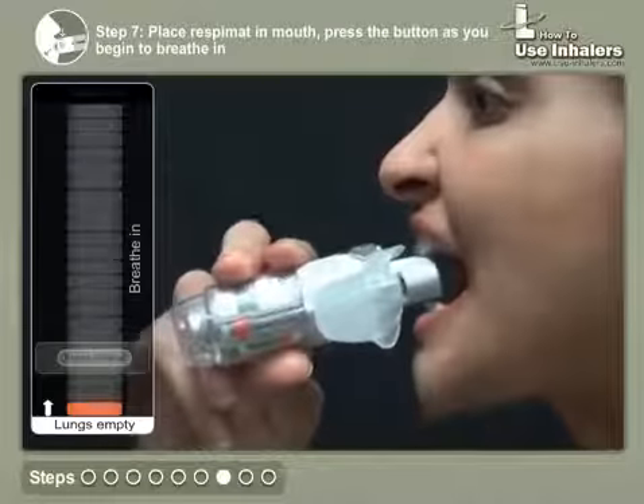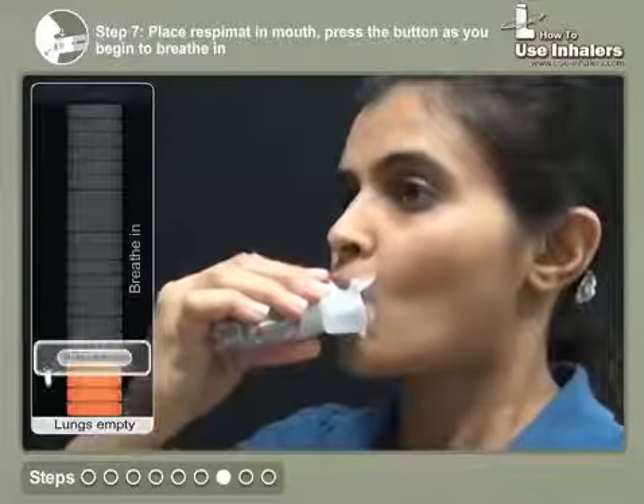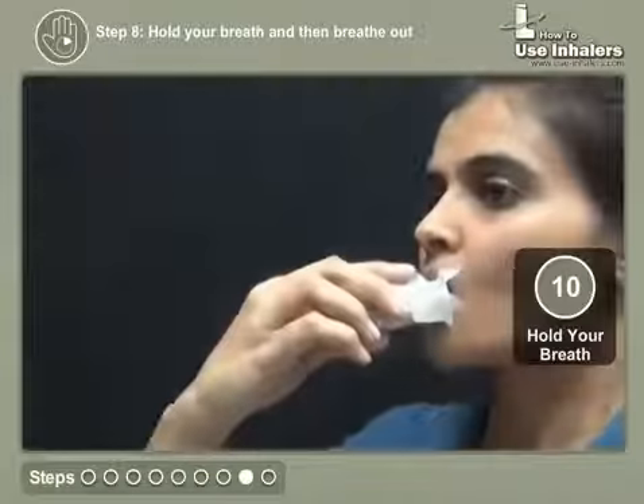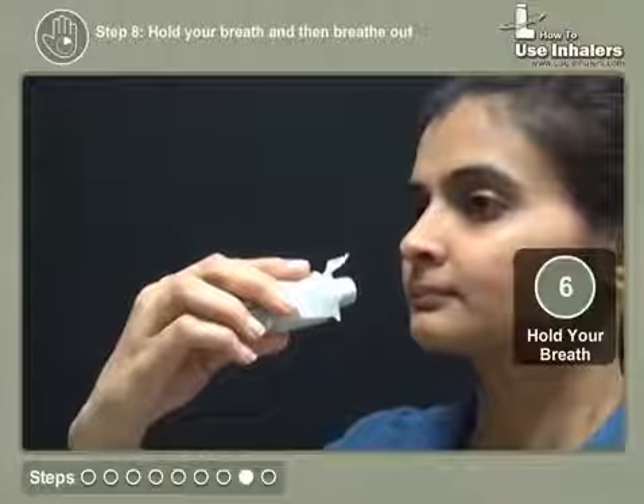Place the inhaler in your mouth. Press the dose release button as soon as you begin to breathe in slowly and deeply. Hold your breath for 10 seconds, or as long as you are comfortable, and breathe out slowly through your mouth or nose.